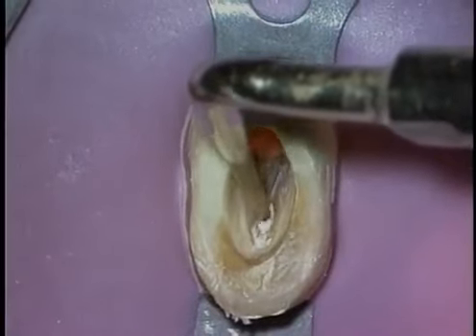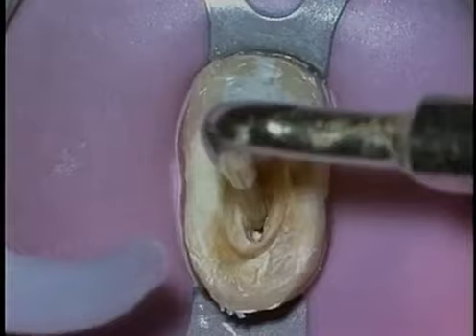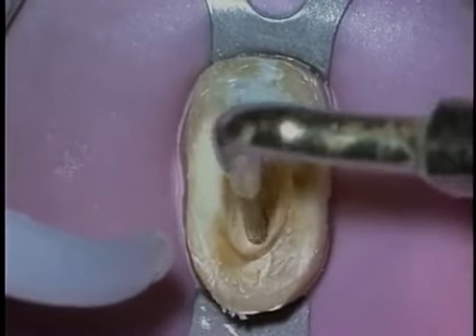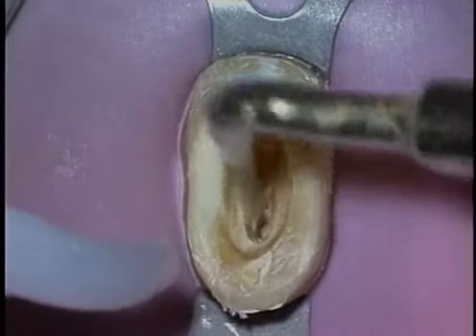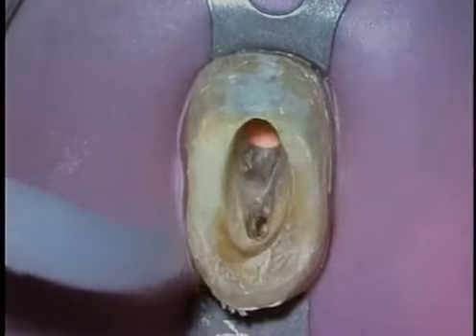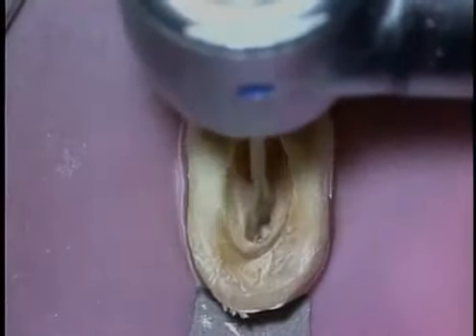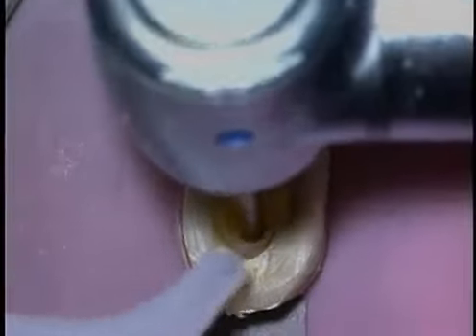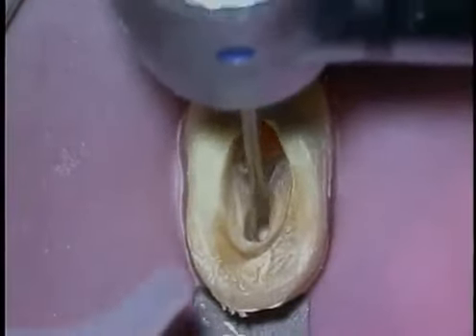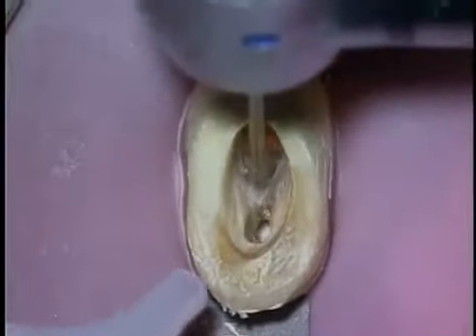Here, an Endo 3 parallel-walled ultrasonic instrument is used. Its zirconium nitride coating allows it to delicately sand away minute amounts of tooth structure in a very controlled fashion. Face off the orifices with small Gates Gliddens. If the orifice is restricted in diameter, it's okay to face off with perhaps a 1 or a 2 GG, and that'll create a guide path for a larger Gates Glidden.